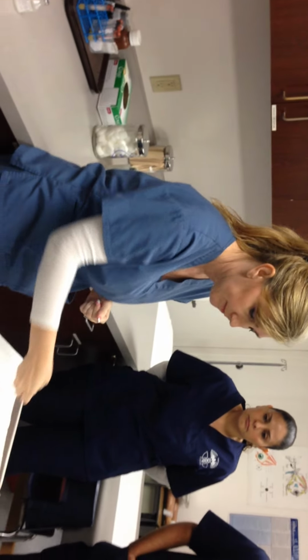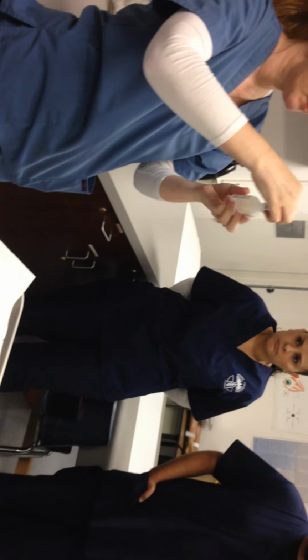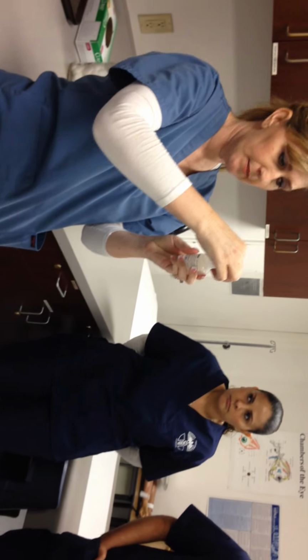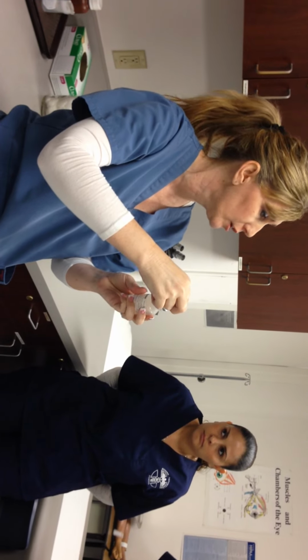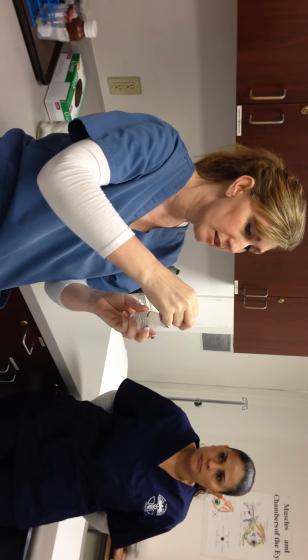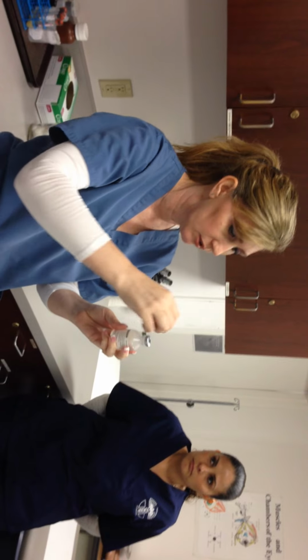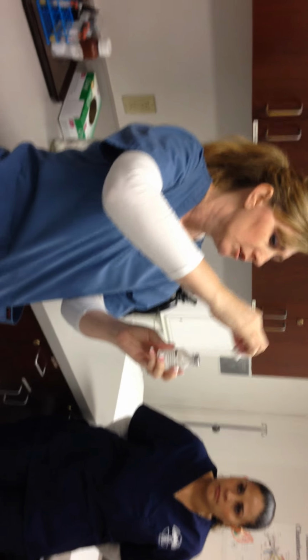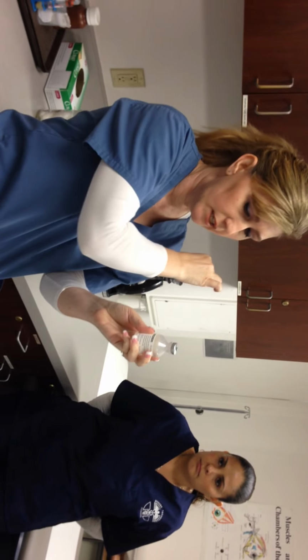What I'm going to do then, I'm going to clean off. See this? So you push it and it kind of comes up out of here. Okay? You're going to clean off your vial. And what else am I doing? Yep, right medication. So we want to check. Right patient, right medication, over and over and over, 6, 7, 8 times, at least 6. Okay, the 6 rights, 7 rights. Some books say 6, some say 7. I think ours says 6. Okay, we're going to start in the middle. Work your way out, snail shell, cleaning off the top of that.